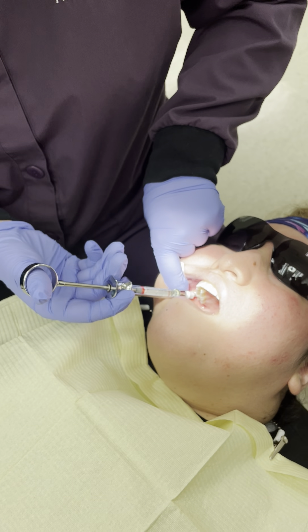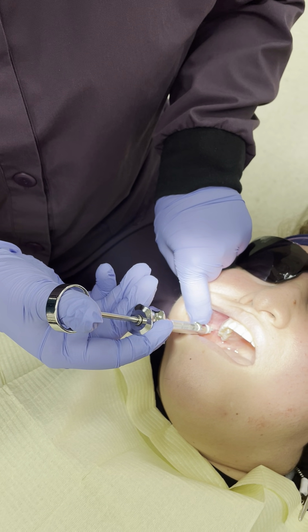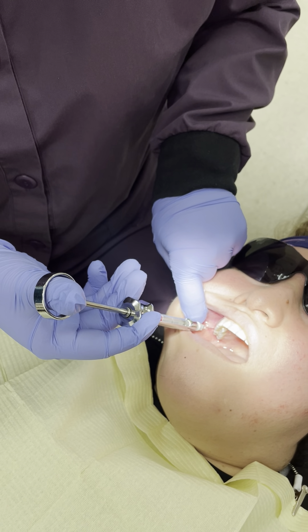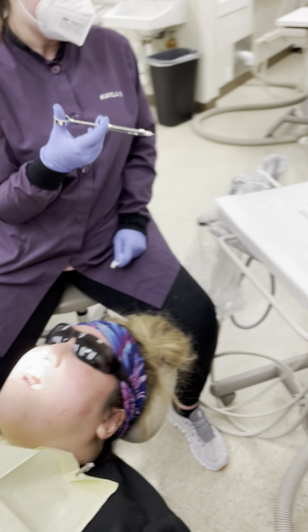You can withdraw. We're going to come out halfway and kind of lift up as you withdraw. When you pull that needle out, don't touch it to anything — not your glove, don't rub it against the lip. Just control that syringe.